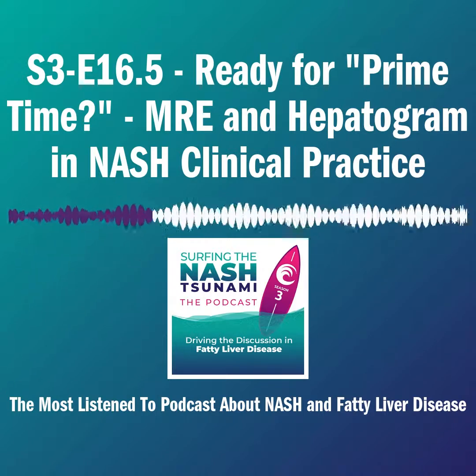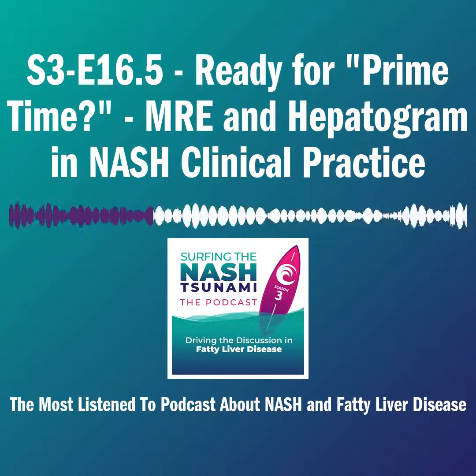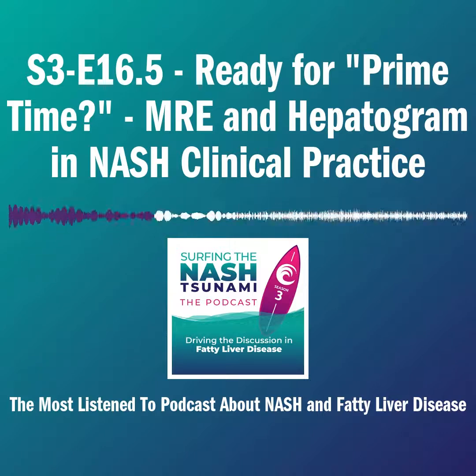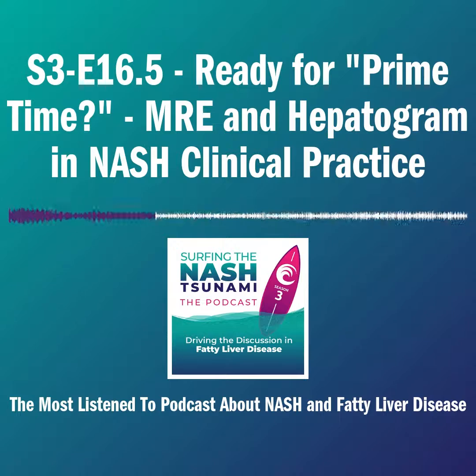And then typically we also want to add proton density fat fraction, PDFF, to this as well, which is also a 20-second breath hold. So you can be in and out of the magnet with both an MRE elastogram and PDFF, which we almost always do together, in less than about 10 minutes of table time. And so we usually schedule these in about a 15-minute slot.